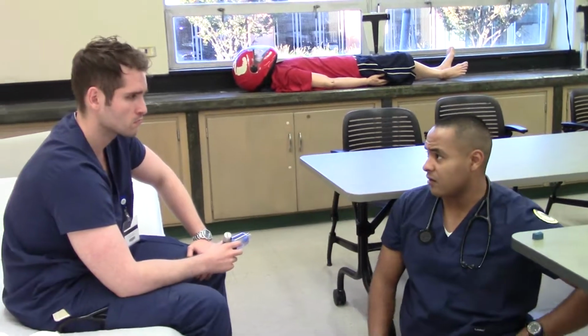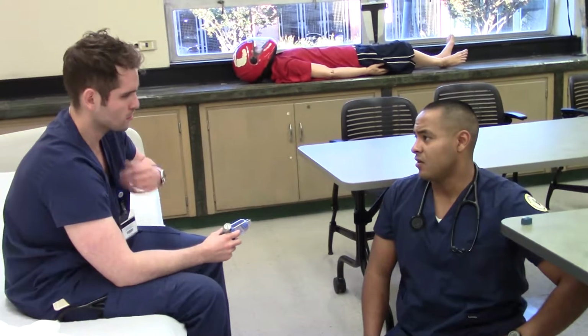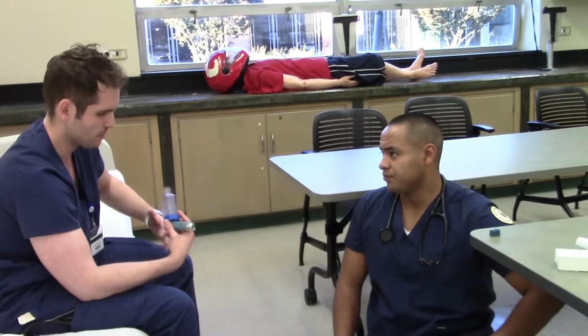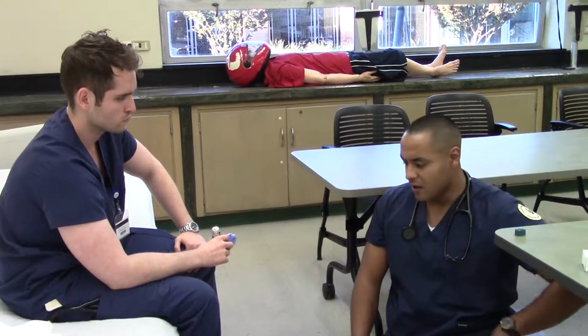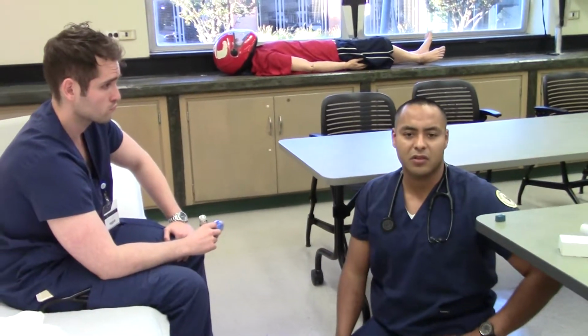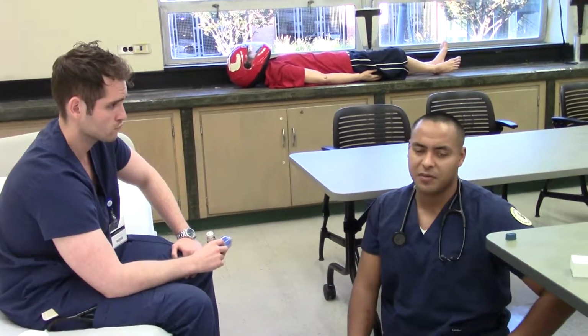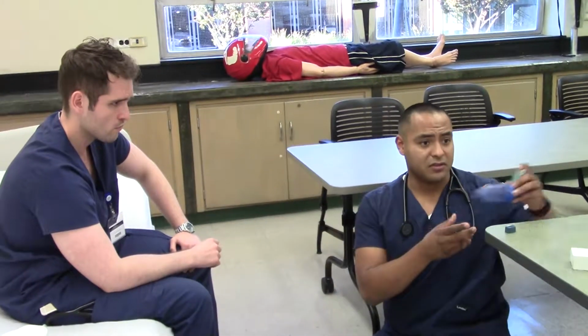Now, how do you feel when you breathe? I feel like there's more air in it. I'm able to take deeper breaths. Okay, cool, that's good. I'm gonna go ahead and just check vitals again. The patient will be able to tell me how to work the device, that's important. You don't want the patient to go home without knowing what to do, okay? Okay, cool, there we go, thank you so much.